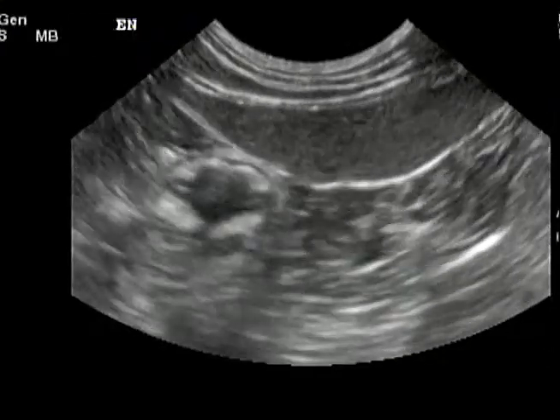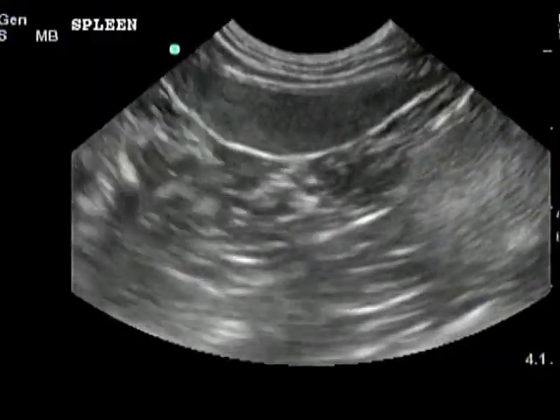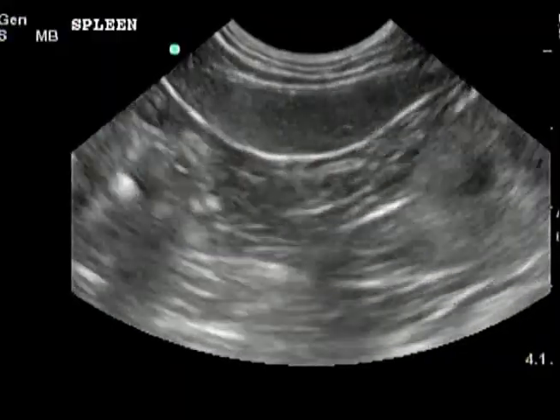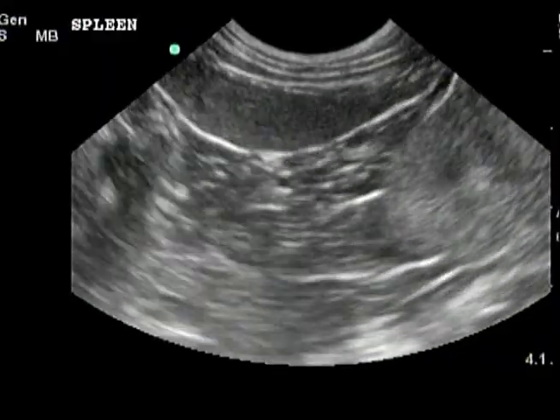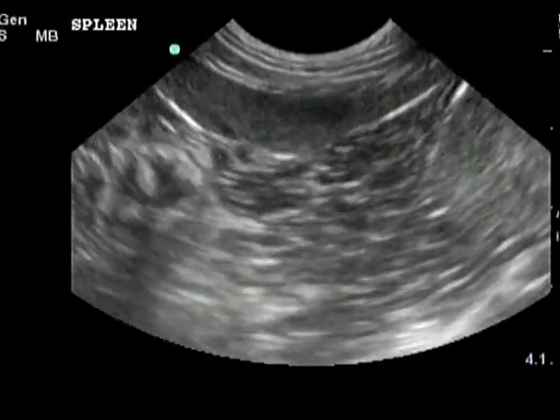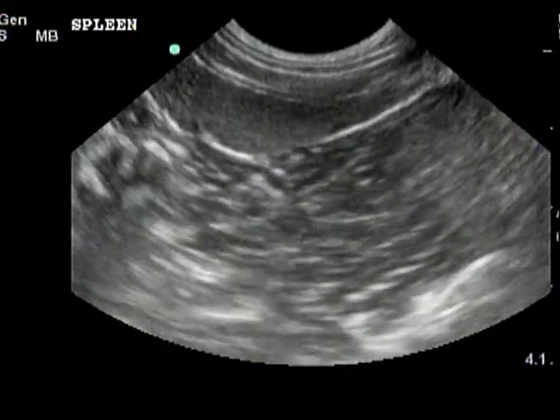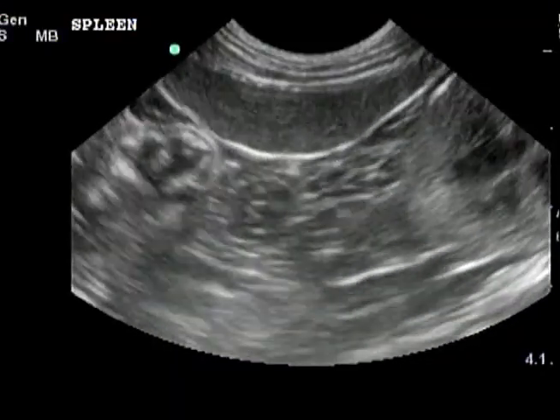In this video of a normal cat, landmarks of the caudal wall of the stomach, spleen, and left kidney help indicate the location of the left limb of the pancreas. Ultrasound lesions of the pancreas are frequently not seen even if pancreatitis is present.